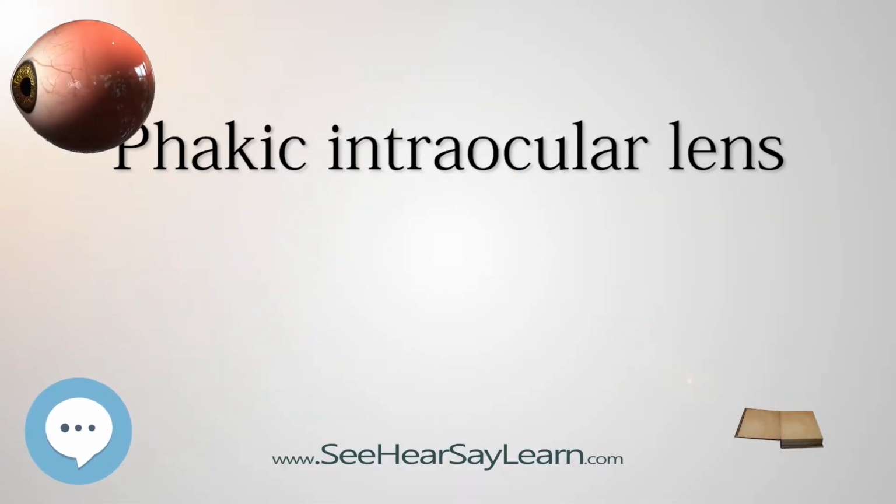A phakic intraocular lens, PIOL, is a special kind of intraocular lens that is implanted surgically into the eye to correct myopia, nearsightedness. It is called phakic because the eye's natural lens is left untouched. This is in contrast to intraocular lenses that are implanted into eyes after the eye's natural lens has been removed during cataract surgery.